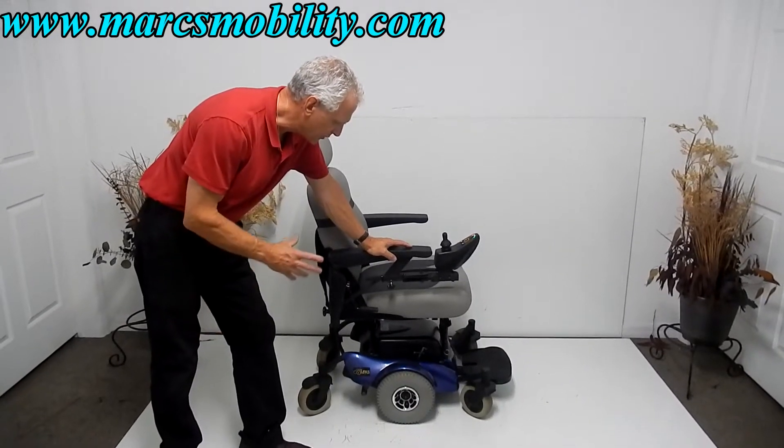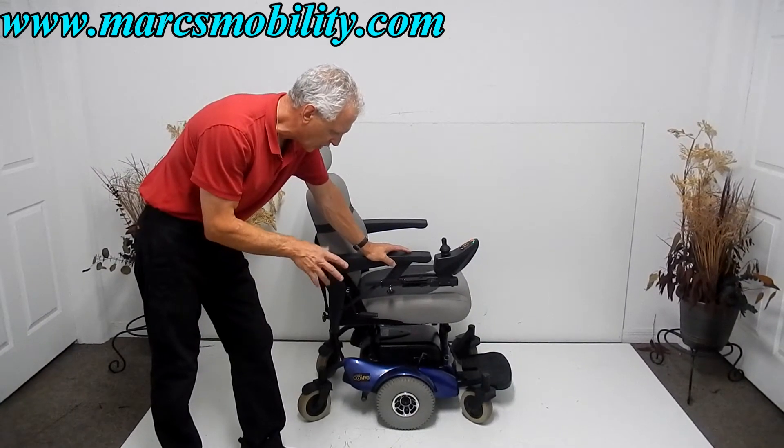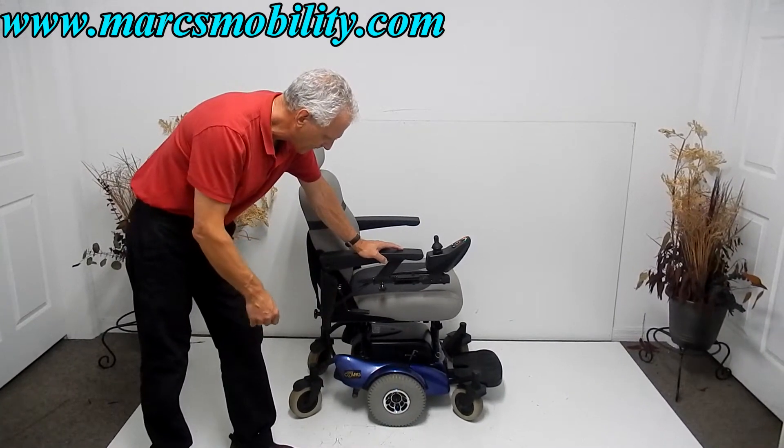This is a Golden Compass power chair, six wheels, made by Golden Technology. This power chair is in excellent, almost new condition. It's a mid-wheel drive, so it has a really good turning radius.